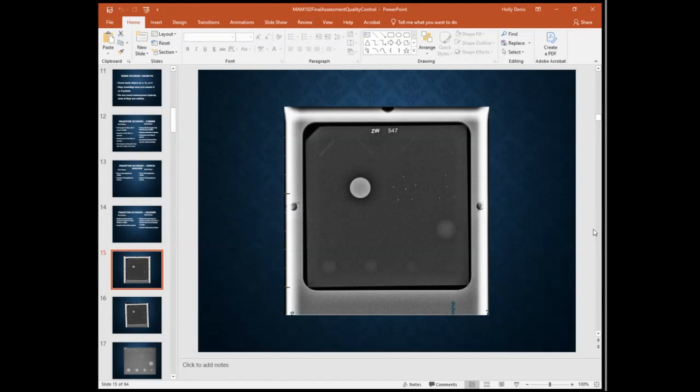Yeah. Okay. I don't see anything in that last group, though, so I don't see anything in that last one. Okay, neither do I. So, yep. And then when we do our masses, this looks like a complete circle to me. So it's going to get a full point.